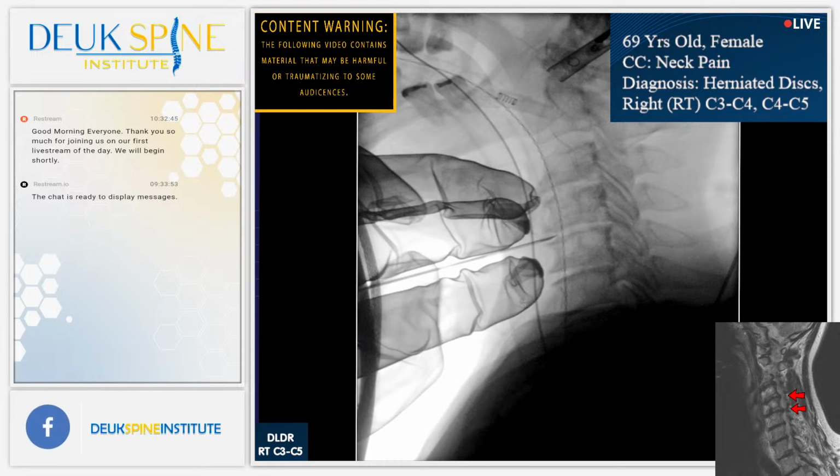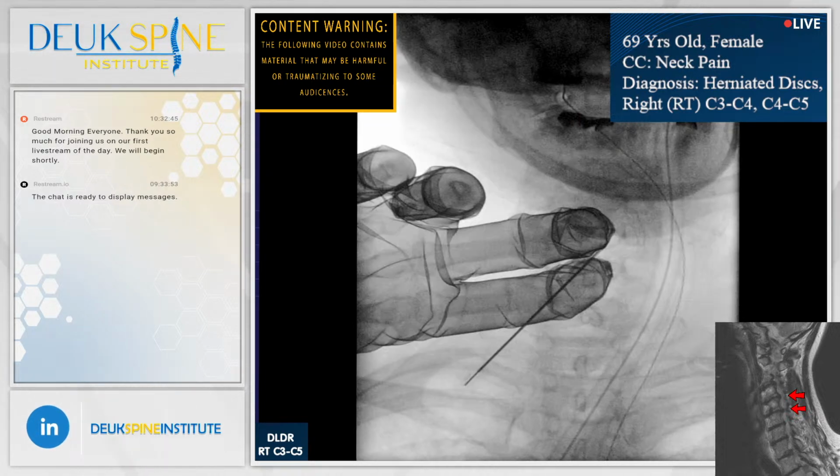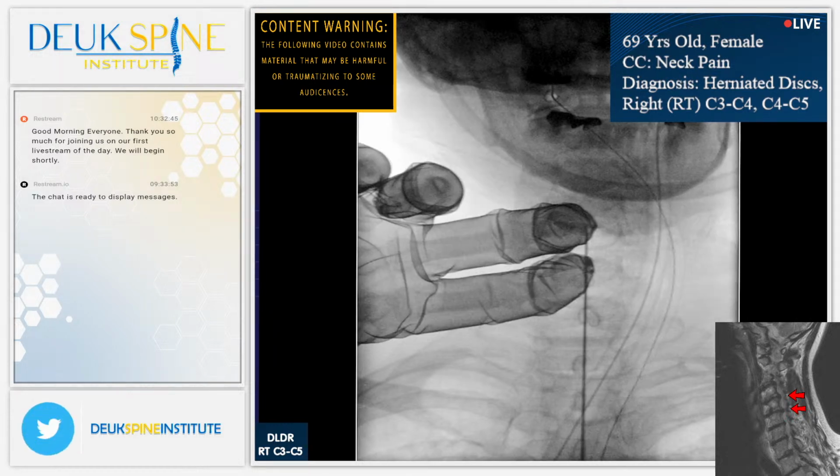All right, so I feel like I'm off to the side. Give me an AP. So I'm not going to go any further until I get a front back view. 2, 3, 4, 5. I'm off to the side. So we need to come back towards me. And shot. That's better, but still a little bit too far to the side. And shot. Let's see. All right, lateral.